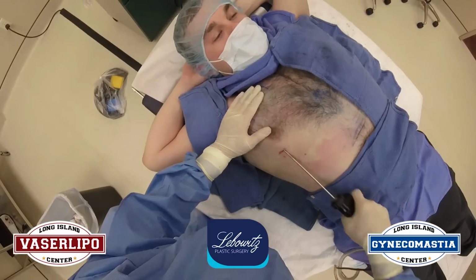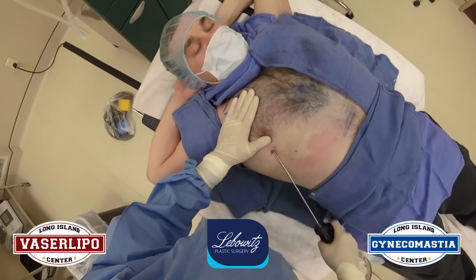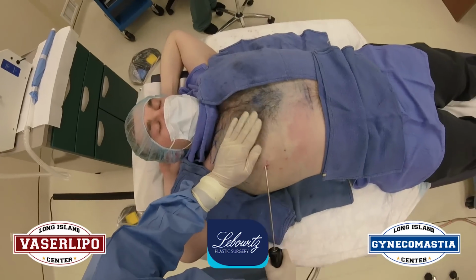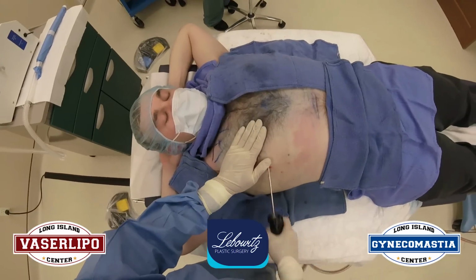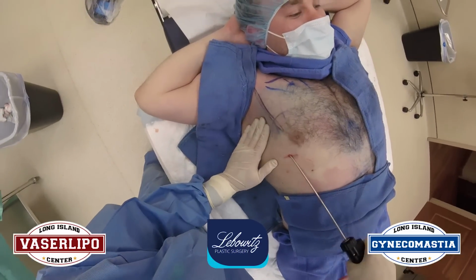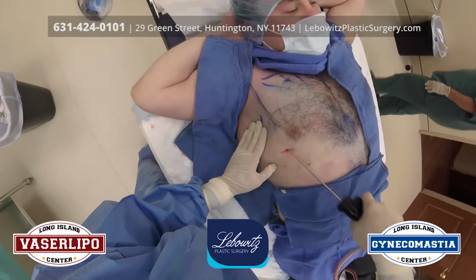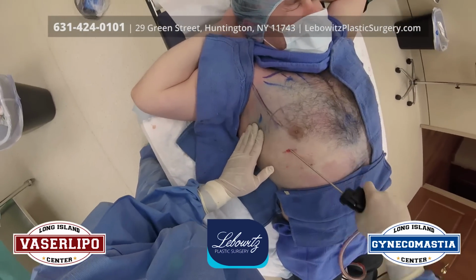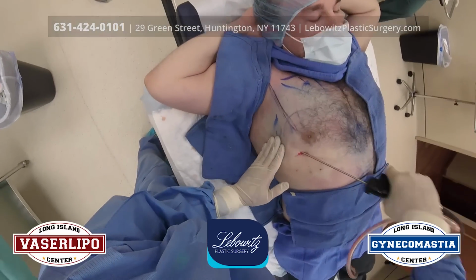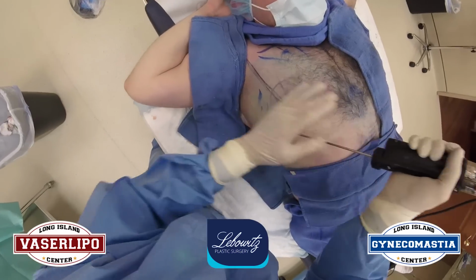So now we sculpt. So we melted, and now we sculpt. You all right? So what this Power X does, it saves my shoulder, basically. Get that nice fine tuning, get this negative space right here. That's what it's all about, positive and negative spaces. We want that beautiful negative space between the lateral aspects of the pec muscle and the anterior portion of the latissimus dorsi muscle right there.